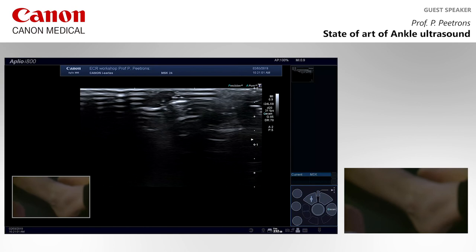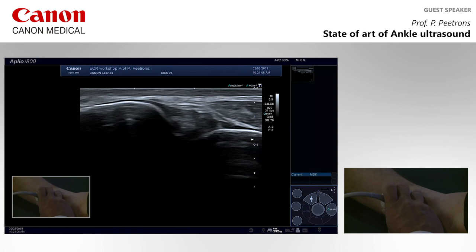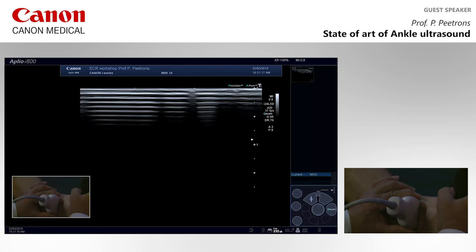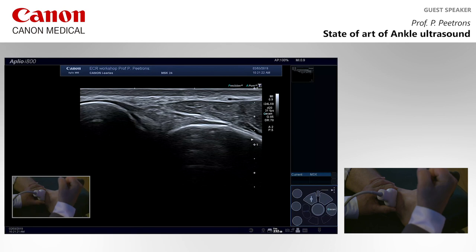I'm sorry, my probe is reversed. So this is the ligament. On the left I have the fibula, on the right I have the tibia, and I see here the ligament between the tibia and the fibula. So when I do a dorsal flexion of the foot, I will push the talus towards the tibia and the fibula, and it opens a little bit the gap between the tibia and the fibula. So this is what I will do.